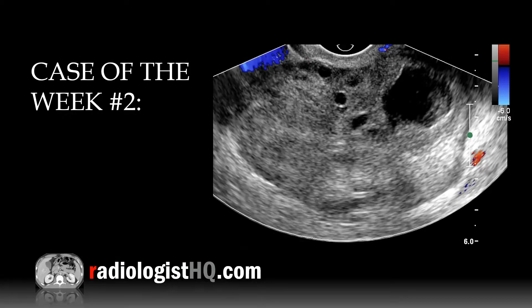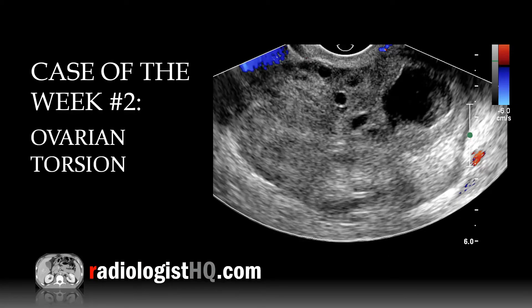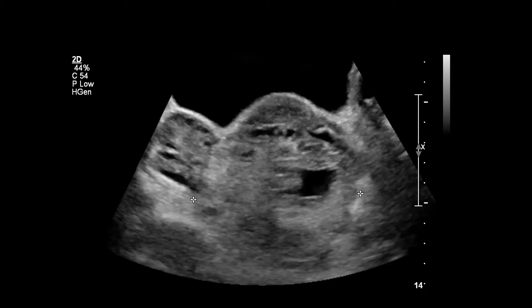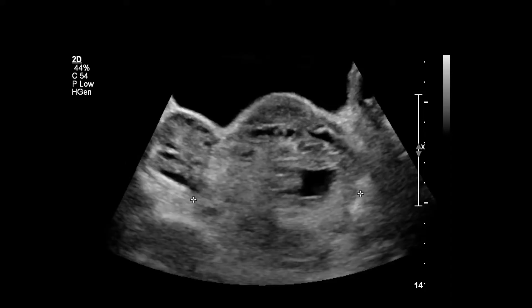Welcome back. This is case of the week number two: ovarian torsion. I'm Dr. Dan Koval. Here we have a transabdominal ultrasound view of the pelvis in a female patient presenting to the emergency department with acute pelvic pain.